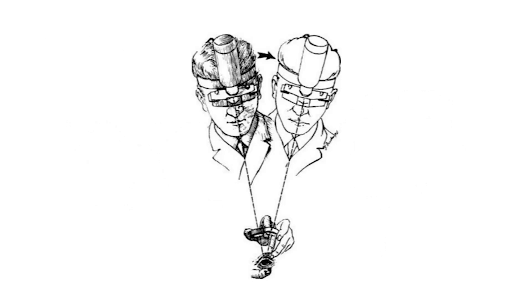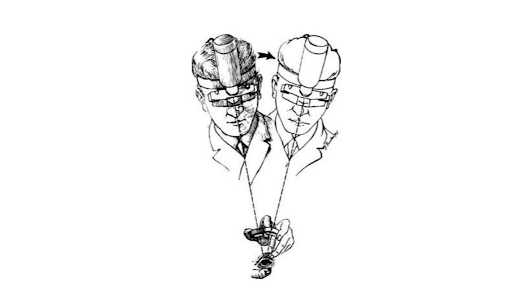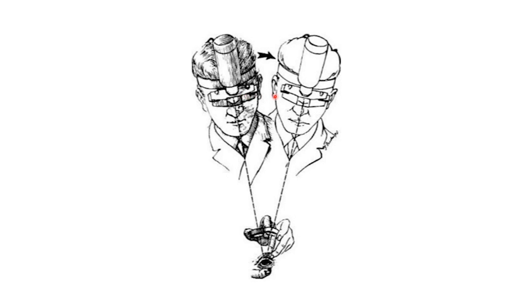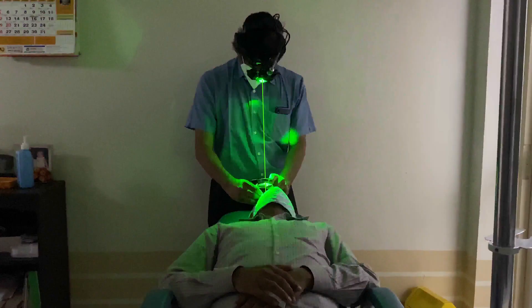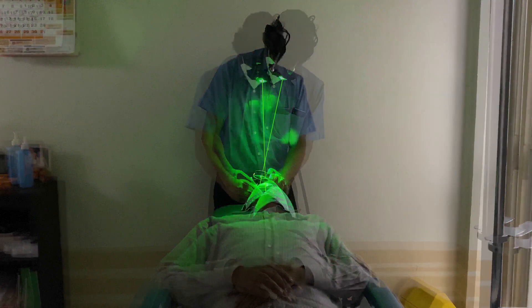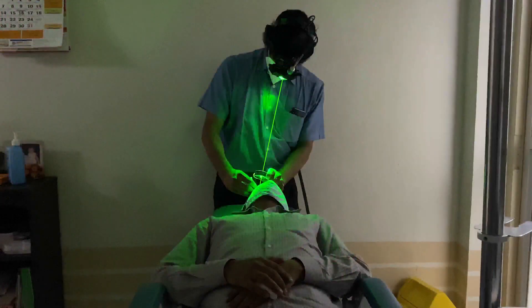When examining with the indirect ophthalmoscope, the examiner makes sweeping movements to observe the retinal details. For this to happen, the imaginary line connecting the visual axis of the examiner, the lens, the patient's pupil, and the area of the fundus being observed should always move together. This is possible only by moving the examiner's head and tilting the lens simultaneously.